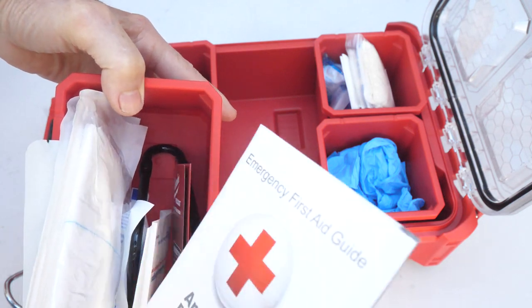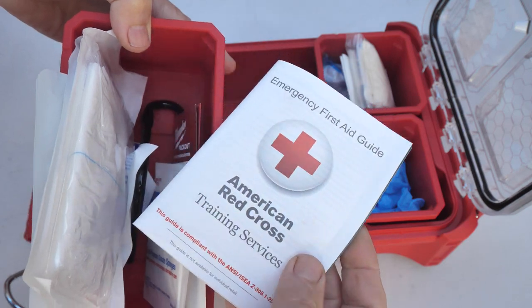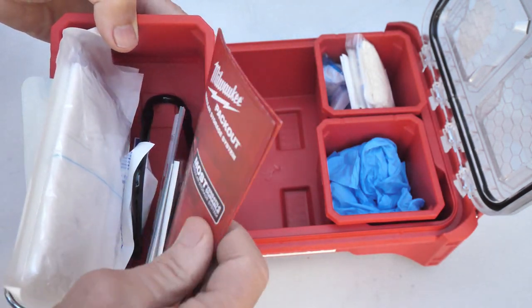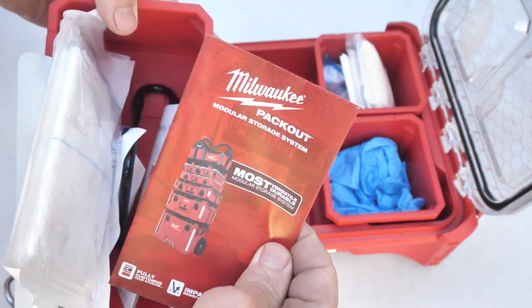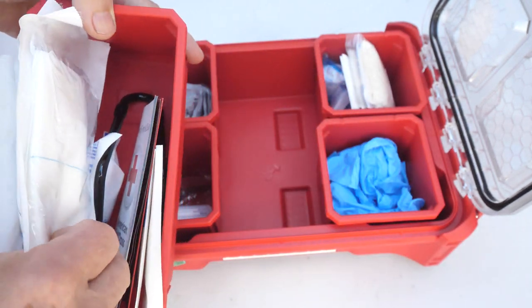Also in this container we have burn dressing and gauze pads. There's a little guide if you're wondering how to treat a certain kind of wound — a quick tutorial on what you might want to do. And there's also a reference card covering all the other Packout items.